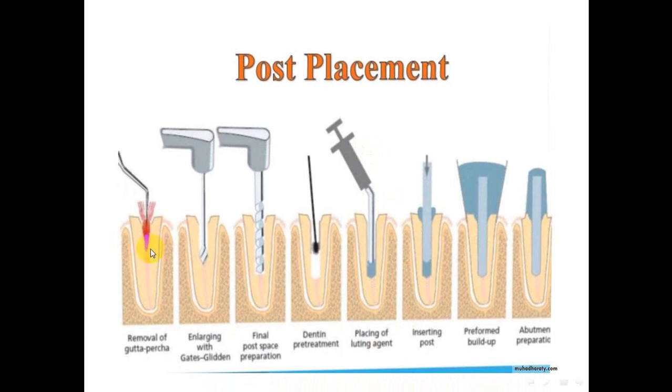First, we start with what we call a fiber optic post, and here is the preparation used to make a site for the placement of the fiber optic post, after using bond and placing some bonding agent and forming a core with a composite.